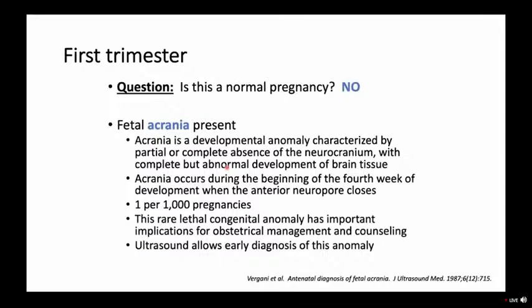So this is the worst form of an open neural tube defect. It's actually not that rare, but you have two neural pores. Our body really is like a zipper, and the front of our body zips together and the back of our body zips together from 0 to 11 weeks. And the zipper did not fuse and close at the top of this baby's skull. And thus you have a lack of the cranium. ISUOG wants us to verify intact cranium. AIUM doesn't mention it. Importance of thinking about how we want to evaluate babies, how we want to do this in our institutions.